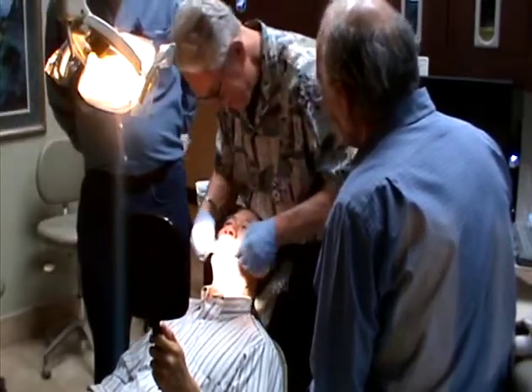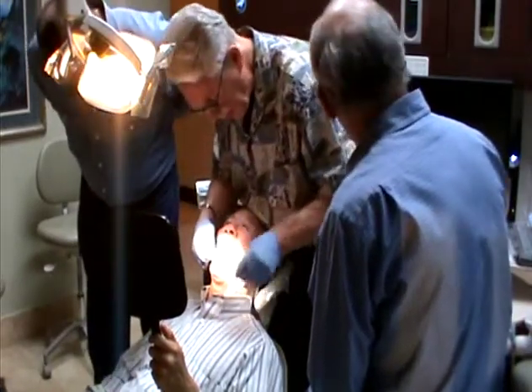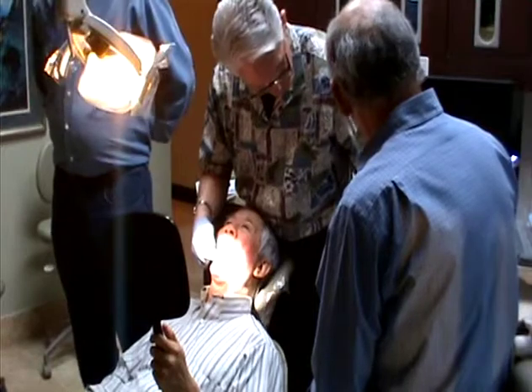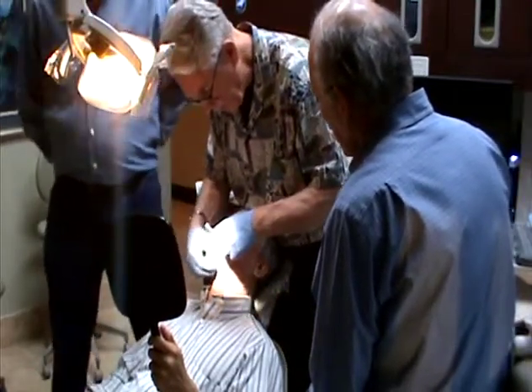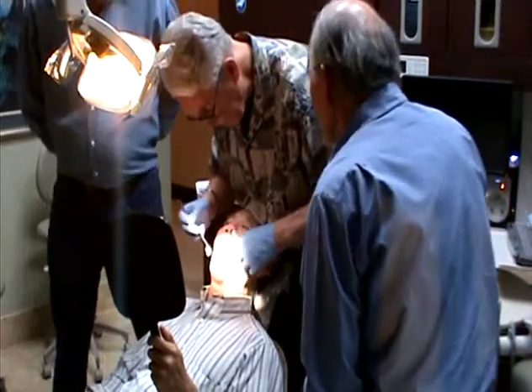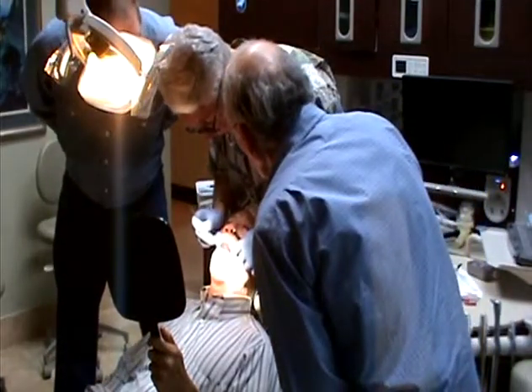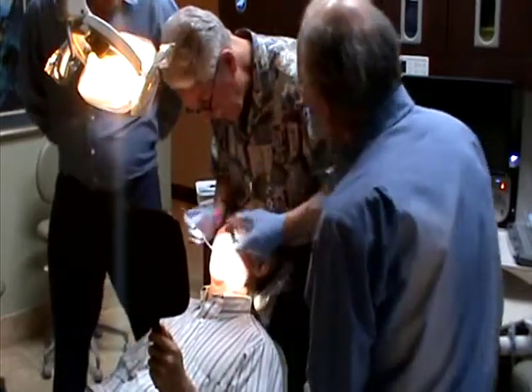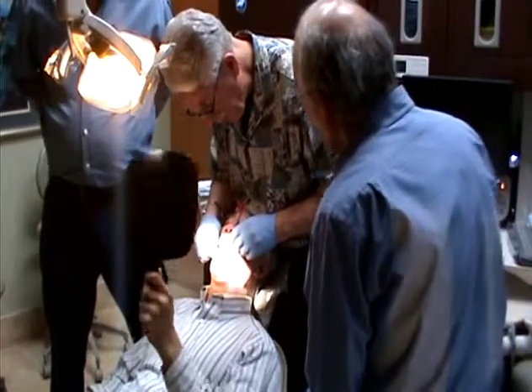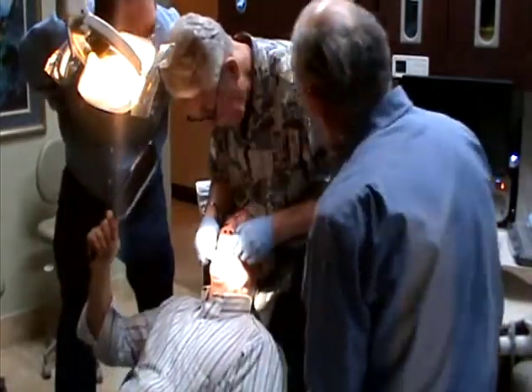Now we're gonna check the other side. If you balance one side, the other side always changes. Just relax. Okay. Leave that heavy one on the bottom. He's hitting real heavy here and real light right here. That'll take care of it.